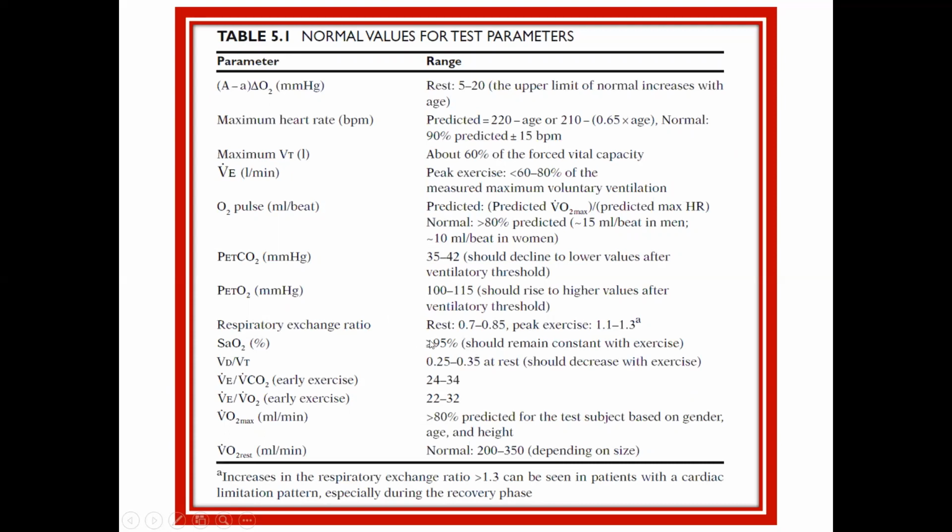Oxygen saturation is usually above 95%, and it's considered abnormal if it drops more than 4% and it's sustained. In other words, once you stop exercising, it takes a while for your O2 sats to recover. That is considered true oxygen desaturation. Otherwise, sometimes you have a finger probe and you're just pressing hard on the handrail. So if your O2 saturation recovers immediately when you stop exercising, that is actually artifactual. If it was a true drop in oxygen saturation, it takes some time before it recovers.